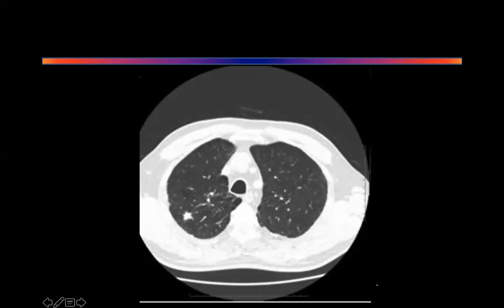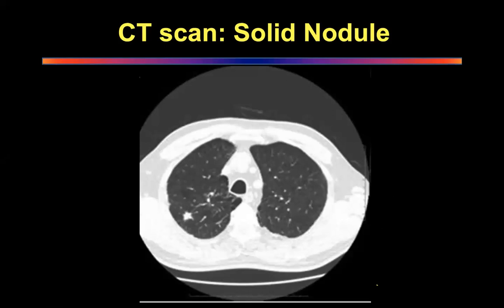A biopsy of the lesion, sir. PET scan. We'll do a PET scan first. PET scan first, and then probably biopsy this lesion. Between the PET and the biopsy, PET will be the second choice? No, if you do a biopsy and then do a PET, the PET will show inflammatory changes. So you should not do biopsy first. PET first, because otherwise you're going to ruin the PET. So always PET first before you do a biopsy.